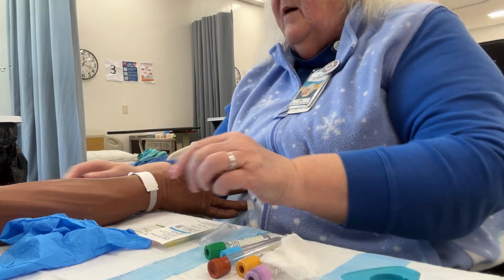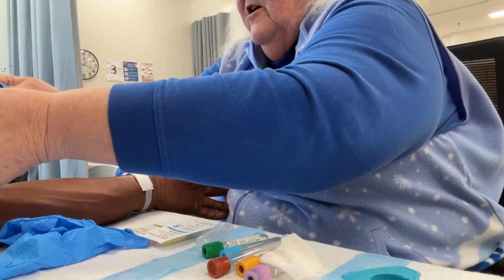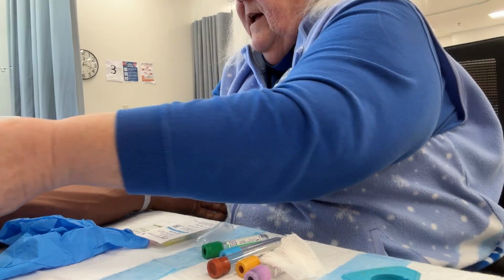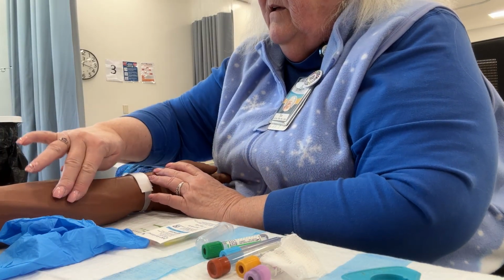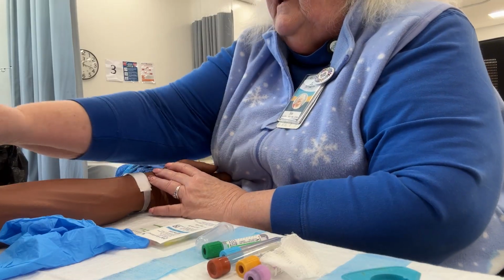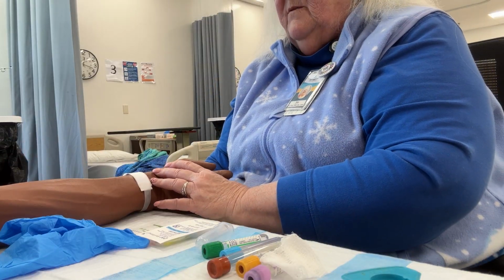No? Okay. I'm going to put the tourniquet on so that I can check your veins real quick. Tourniquet, same as you did it last time. I determined where I'm going to go. I'm going to go right here. Check a couple different spots, see if I see anything better. Nope, I like that. Take the tourniquet off because the most it can stay on is 1 minute.